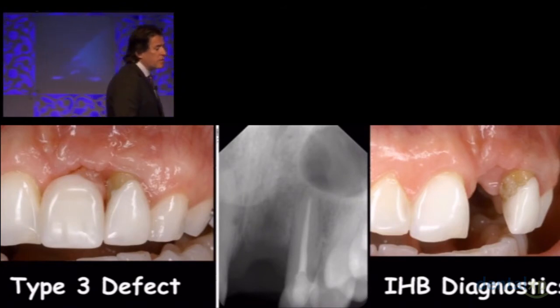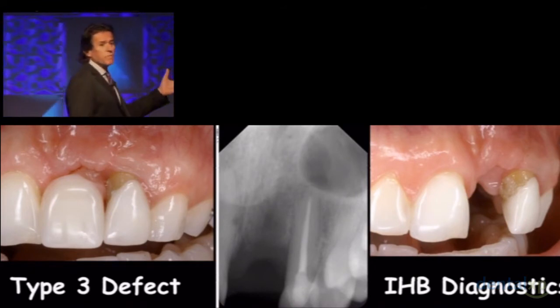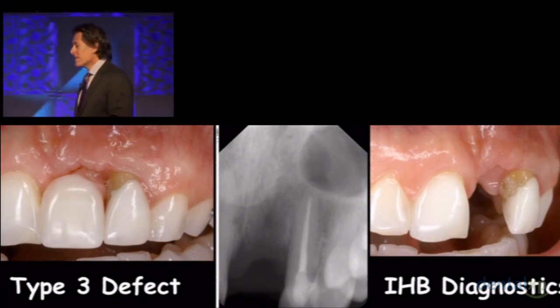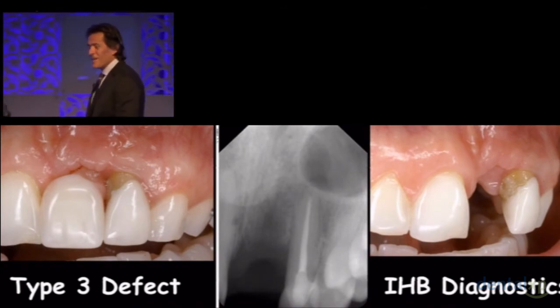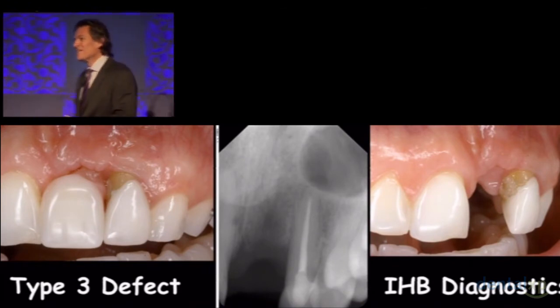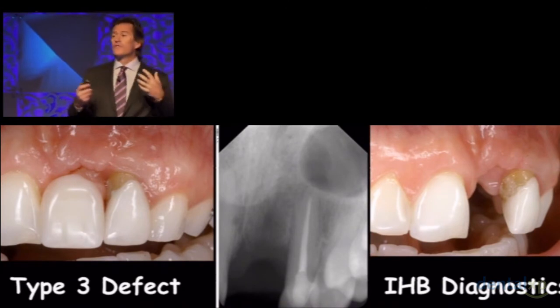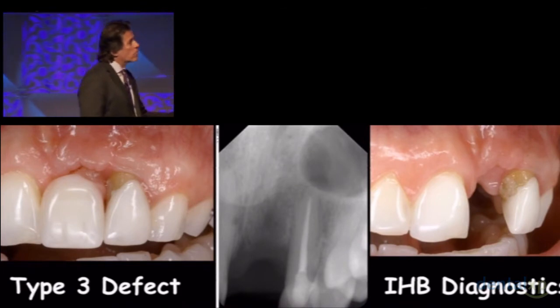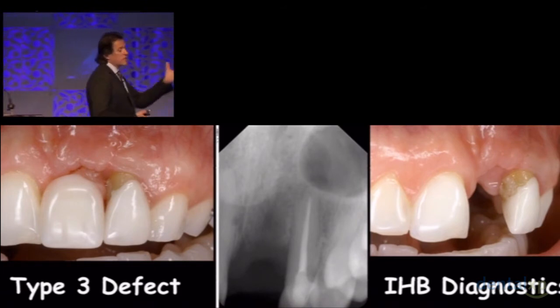Look at this case. Bone is lost. The patient comes in as a second opinion. Immediately, first thing I'm thinking is, it's not that far a drive to Tampa. I usually send all of these to Mike, with a little card saying, hope it's sunny down in Florida. And unfortunately now he starts sending some of those back to me in Atlanta, and it's kind of fun. But these are difficult cases, and one reason is that the cases are treated without a proper diagnosis of the interproximal bone. This bone was lost on the lateral before the implant was placed and failed in the central, causing this type of problem now.